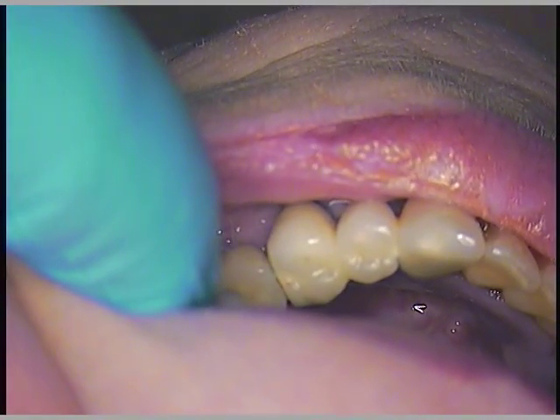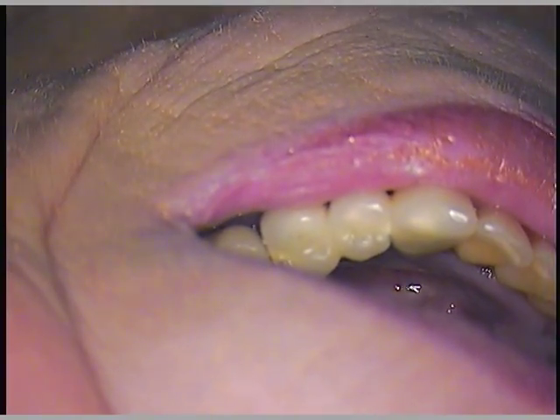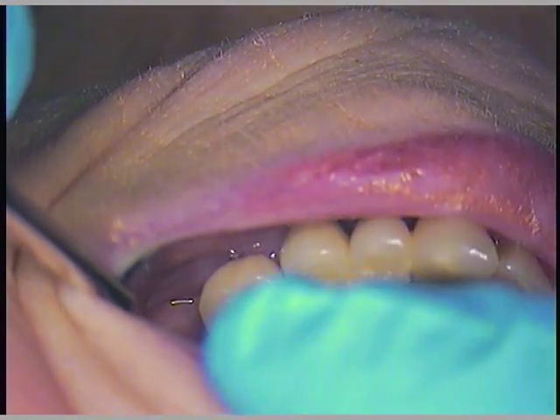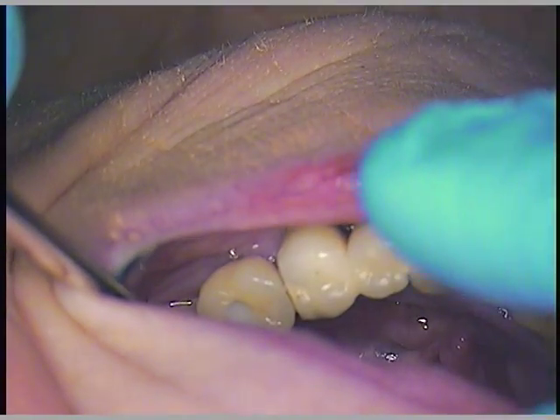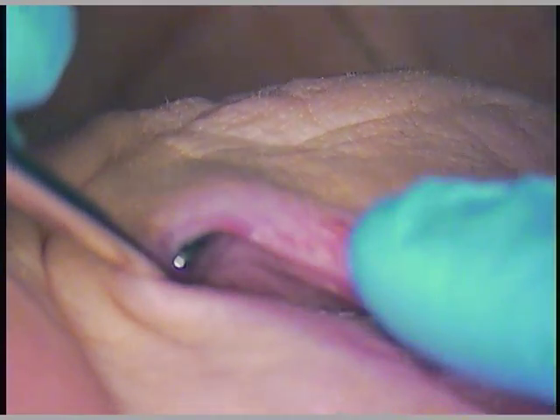We're back. I'm documenting our case with number 19. We're going to go ahead with our loose screw retrieval, keeping the crown, keeping the abutment, putting a new screw in, and checking her bite at the end.